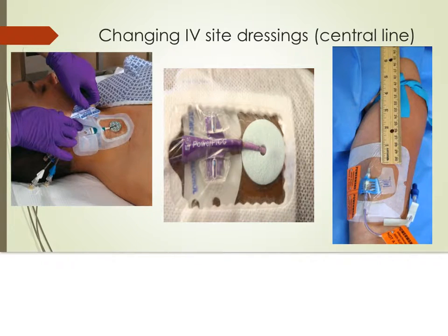Be sure to identify the patient, explain the procedure, provide privacy, and position the patient. Using a clean surface, open the CVC kit and apply a mask to both yourself and the patient. Prepare the rest of the CVC kit in a sterile manner. If the patient cannot tolerate wearing a mask, have the patient turn his or her head to the opposite side.